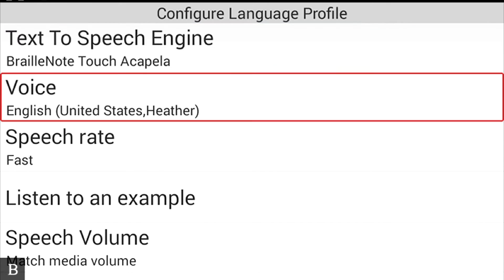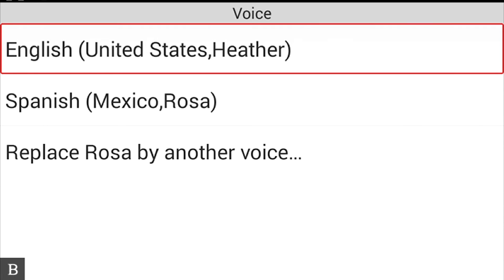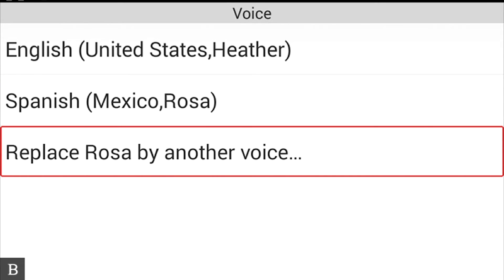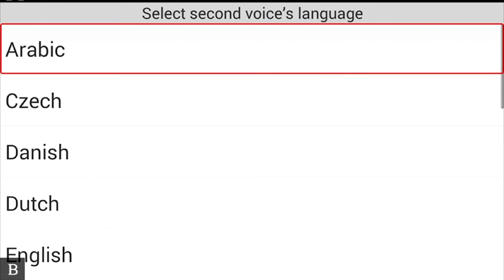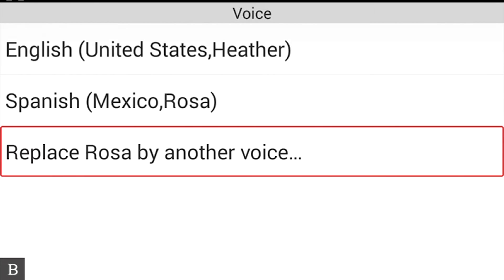The next item is Voice — currently set to English, United States, Heather. I've also got a Mexican Spanish voice called Rosa, which is another Acapella voice I've downloaded. Our contract with Acapella allows two active voices at one time. You can replace Rosa with another voice, and there are many languages supported: Arabic, Czech, Danish, and many more. You can choose any of the voices depending on what you speak.